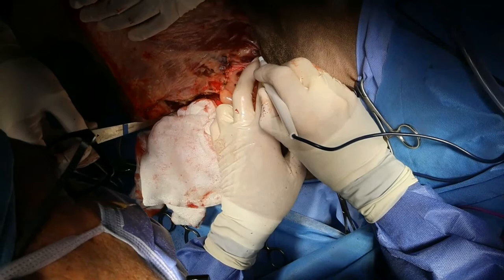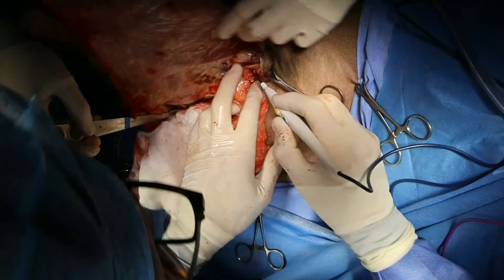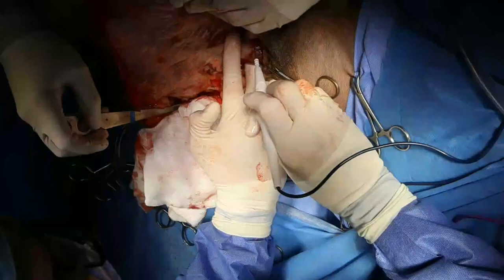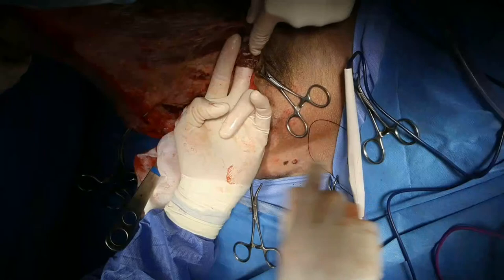So that's iliopsoas muscle right there. And what travels through the iliopsoas muscle? Sean? We've done an epidural. Yep. Femoral nerve. Right, yes. Right under. Oh, so that's the femoral nerve getting excited right there. And that's the femoral nerve right in the middle of the iliopsoas.